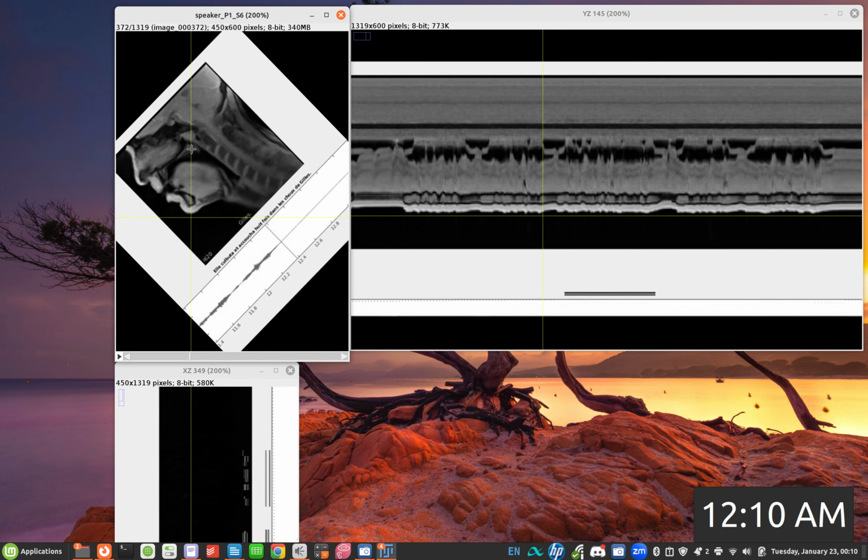Why? Because we can see that the velum is making contact against the velopharyngeal port right here. So this should be the line of the movement for the velum. We need to verify that by sliding this slider left and right, and then see that this is the case. The vertical line should cover the space, the white pixels, when the seal is being made in the velar port.